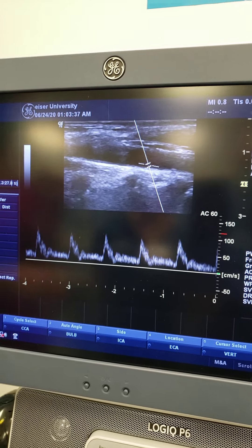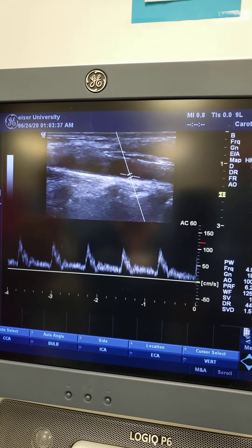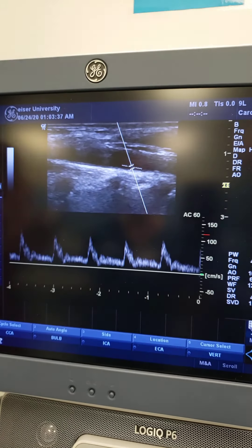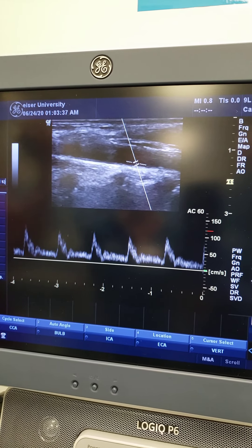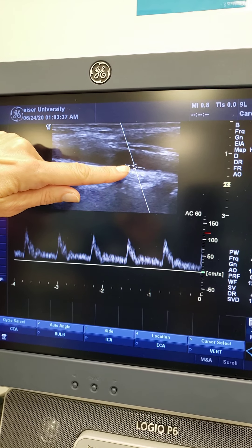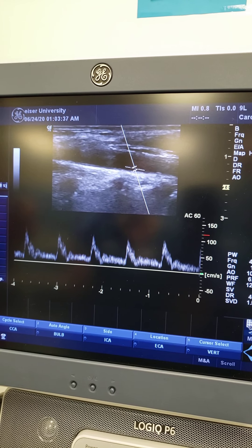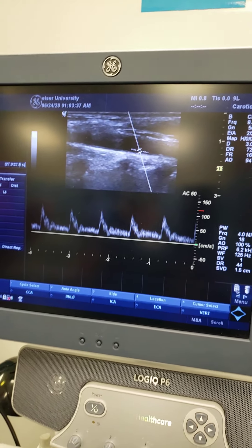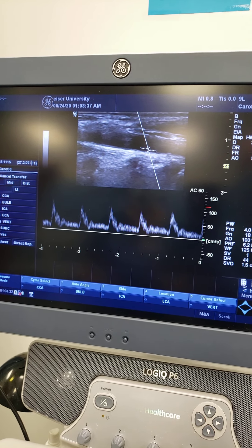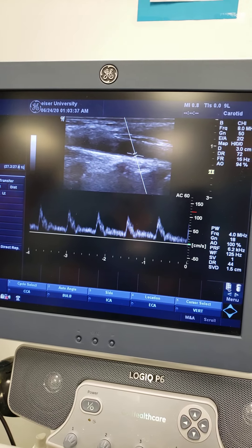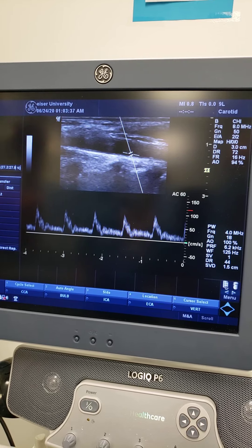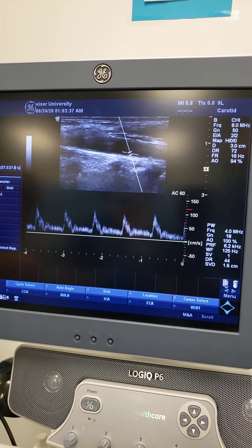So did you see I had to work at that? It's not easy. Half the battle is you guys being able to find the vessel, staying on it, and getting that 60. Because we set the guide up so we know the guide's all set. Now it's us rocking it until the vessel wall is parallel with the guide that we set. Is there a certain pressure you should apply? Well, you don't want to put too much pressure that they can't breathe — you're going to cut off their blood flow. You want light pressure, but you're going to have to rock it a little bit.